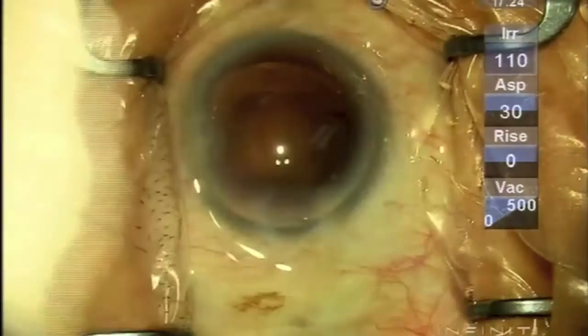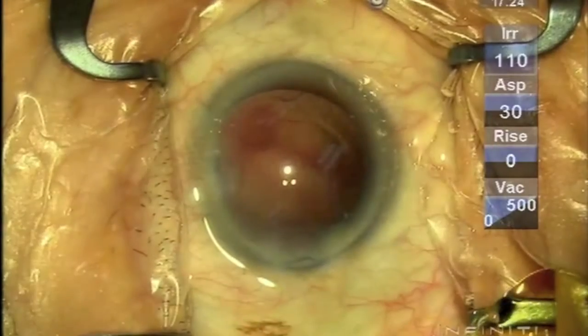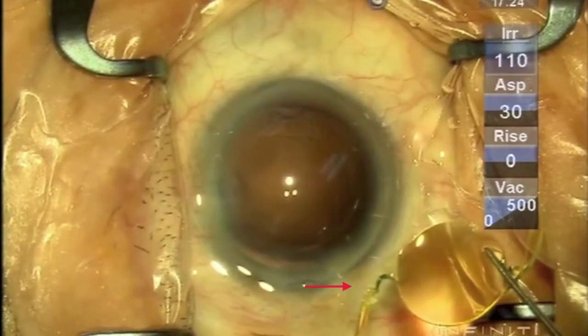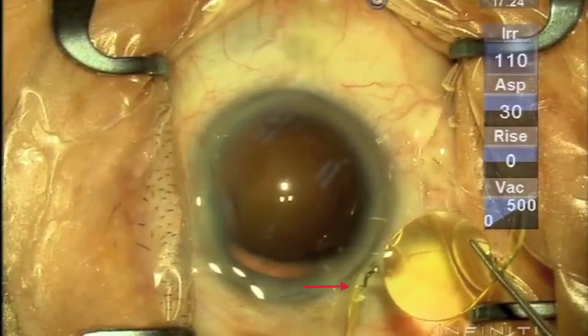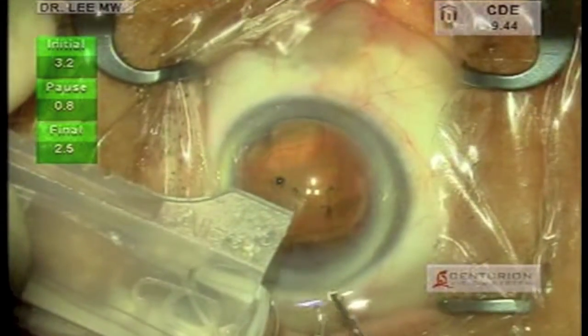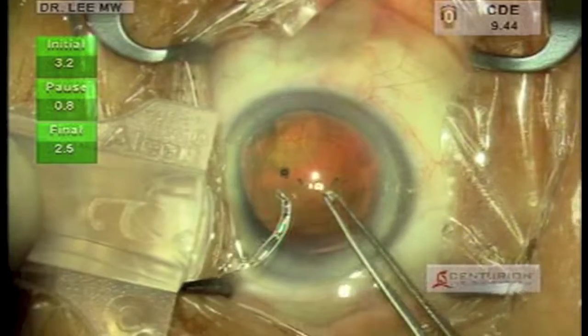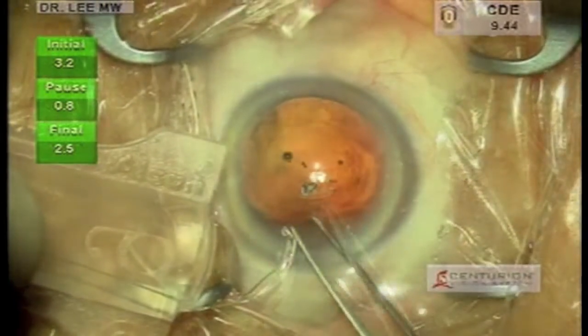The first pearl is for careful intraocular lens inspection prior to inserting it into the eye. As illustrated in these two examples, there were defects in the leading haptic in the first instance and the trailing haptic in the second. One must be vigilant to spot these manufacturing defects before inserting the intraocular lens.